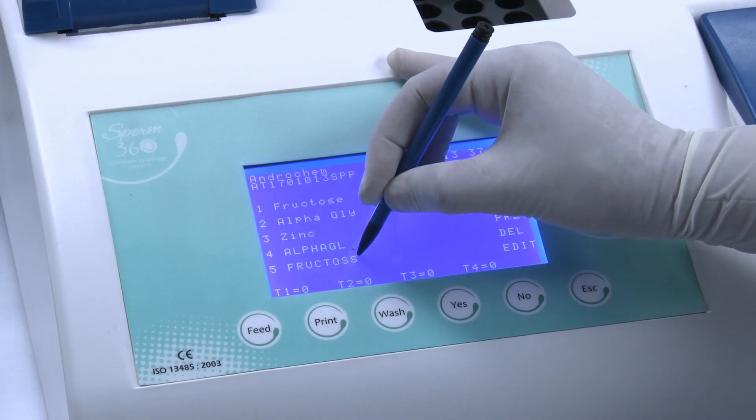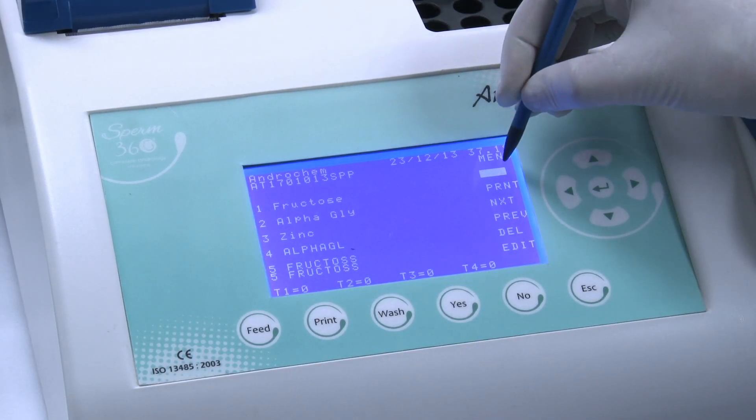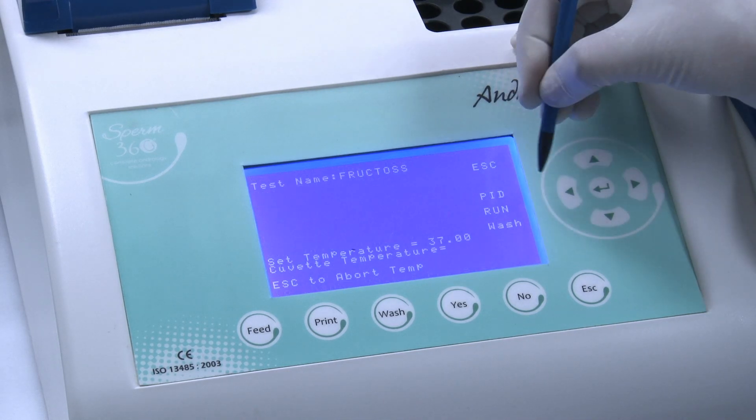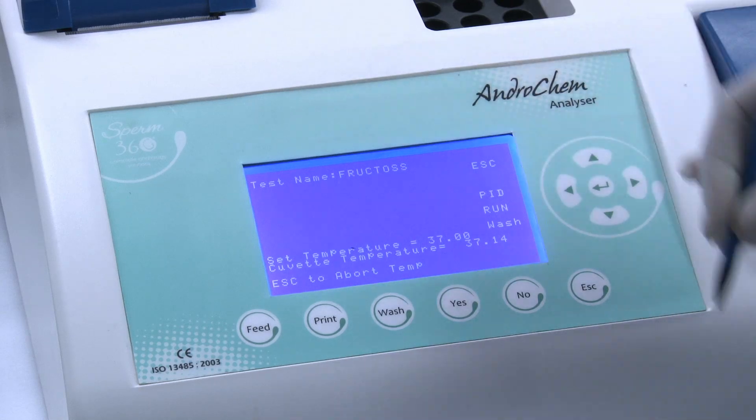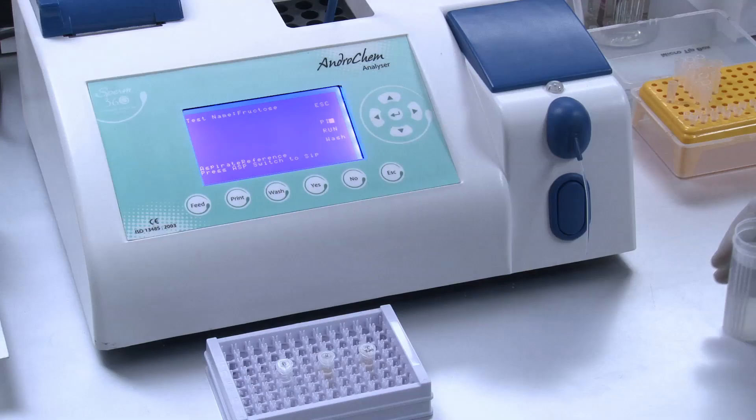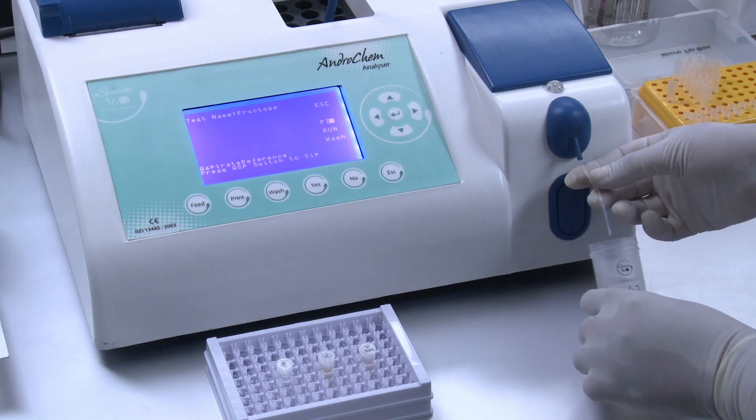Choose the program Fructose from the Androchem Analyzer and choose Run. The screen displays Aspirate Reference, Aspirate Distilled Water.